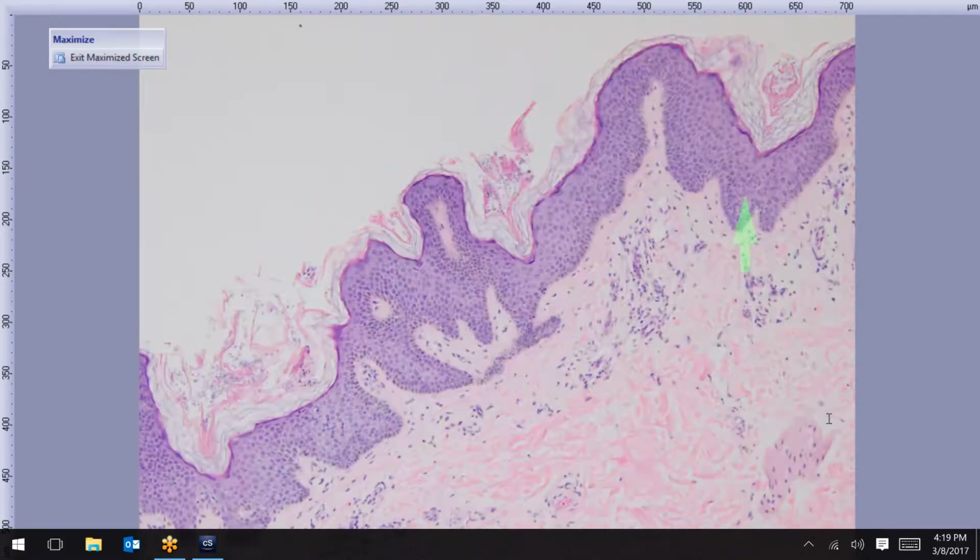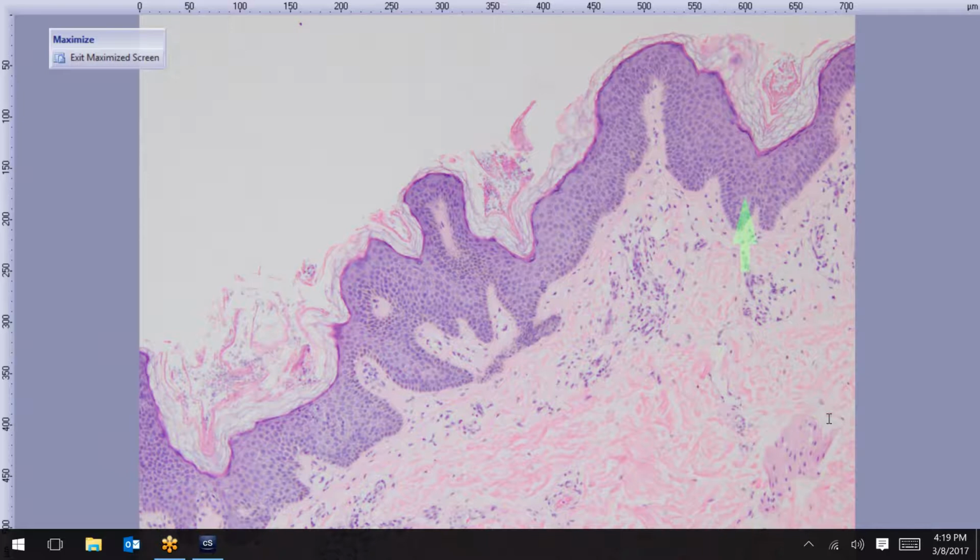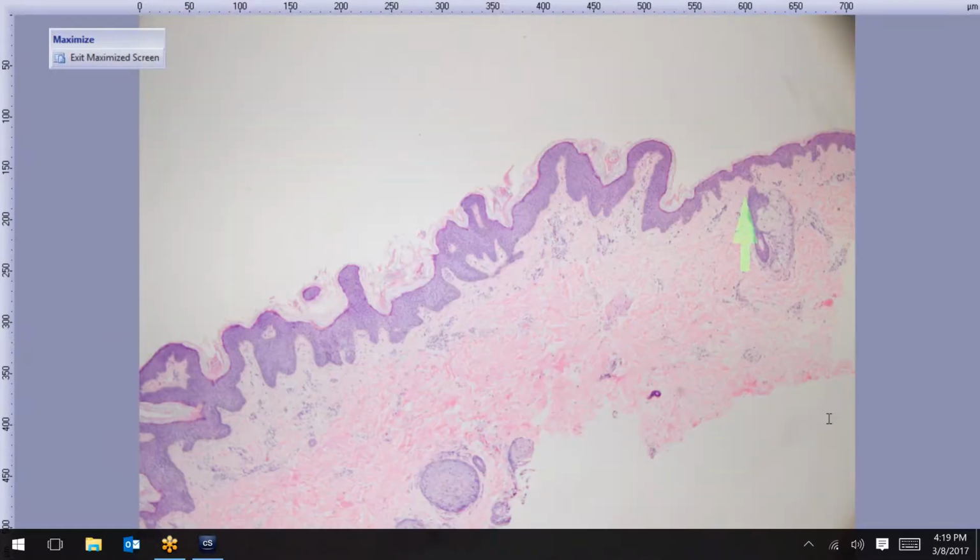So this comes with a differential diagnosis, and it really depends a lot on the clinical context. All those comments you guys put in are perfect. You said acanthosis nigricans. Absolutely, if this were on the back of the neck of somebody with velvety patches, that's what it is. Or if it's central chest or central back with hyperpigmented velvety plaques, it would be confluent reticulated papillomatosis.